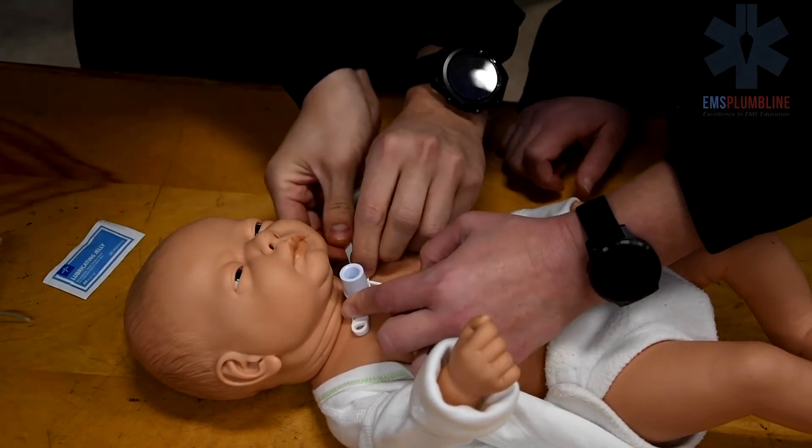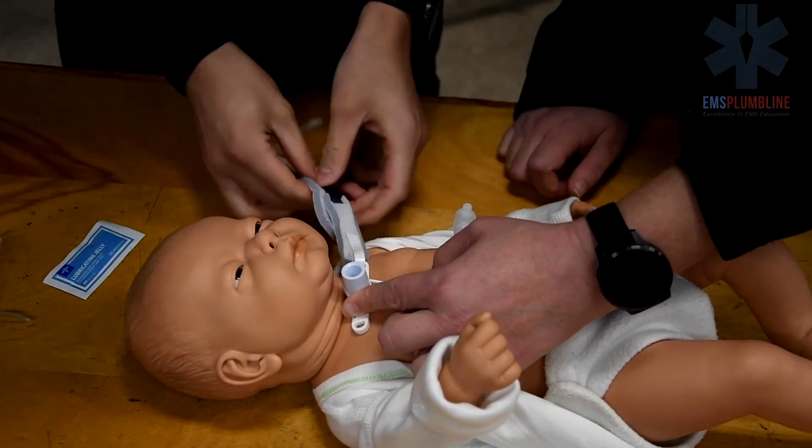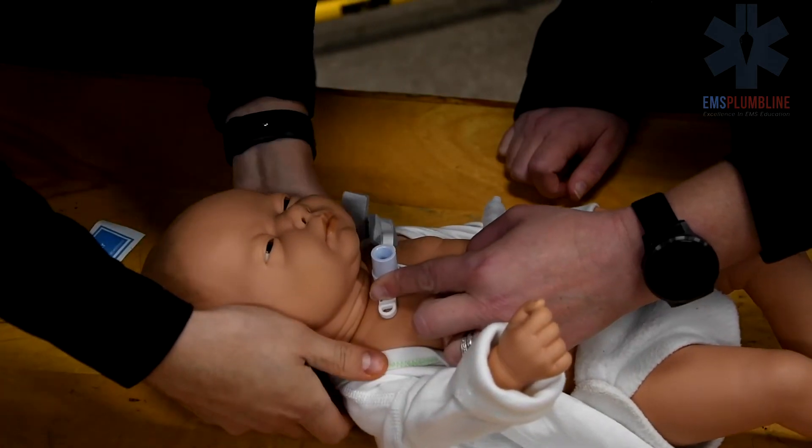Attach the trach ties. Ensure the ties are one finger breadth tightness. Tighten as needed.